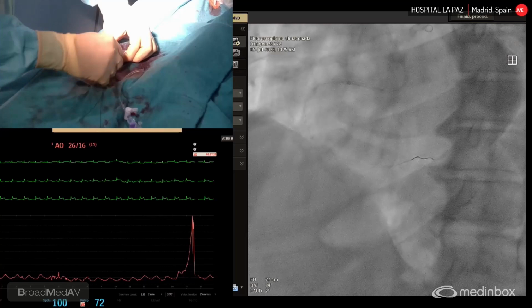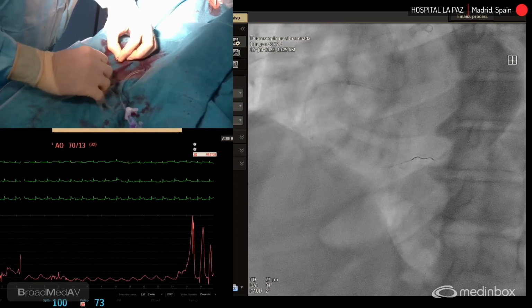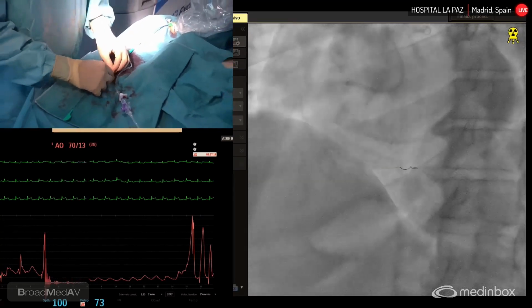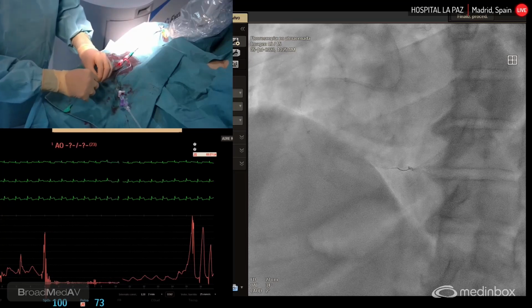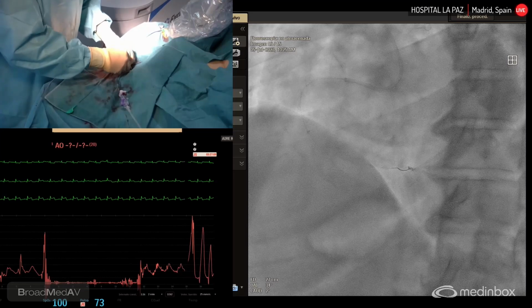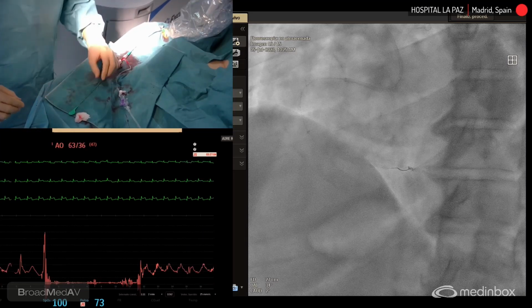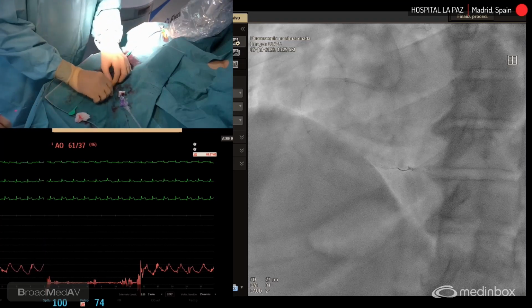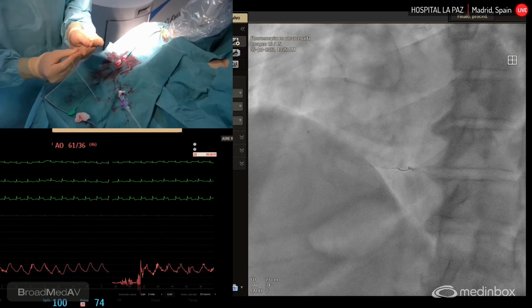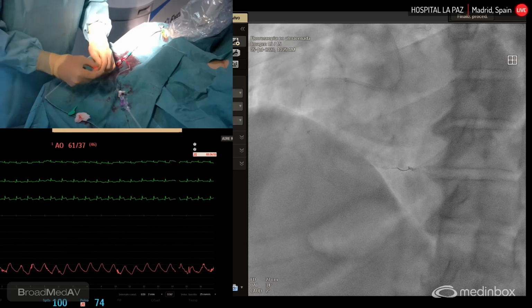So let's do a new OCT. Danny, please, the short pullback. Yep. Okay.